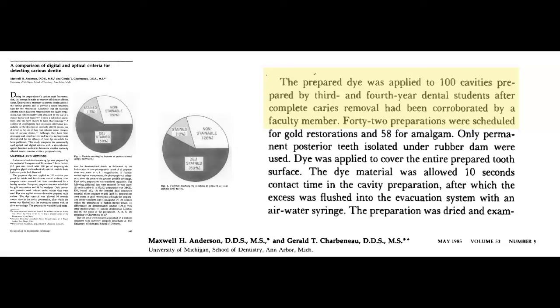So 2 millimeters within that DEJ, we want to make sure that we have nice and clean enamel so that we can call that the peripheral seal zone, and that we know that we can accomplish the highest bond strength to seal our preparations in that peripheral seal zone.